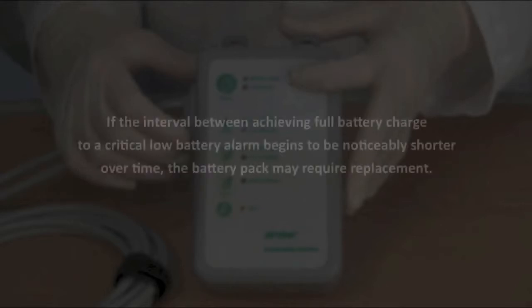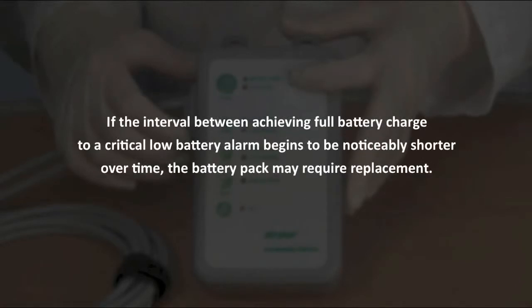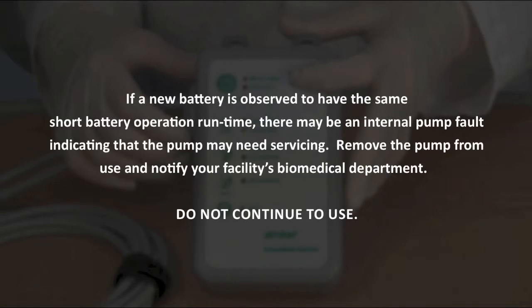If the interval between achieving full battery charge to a critical low battery alarm begins to be noticeably shorter over time, the battery pack may require replacement. If a new battery is observed to have the same short battery operation runtime, there may be an internal pump fault indicating that the pump may need servicing. Remove the pump from use and notify your facility's biomedical department. Do not continue to use.